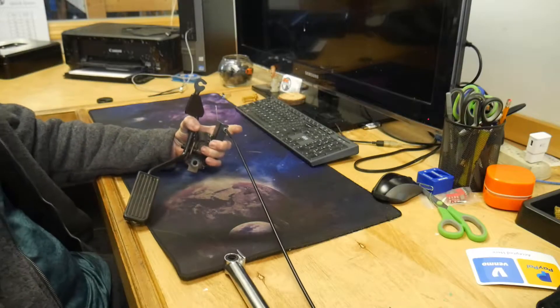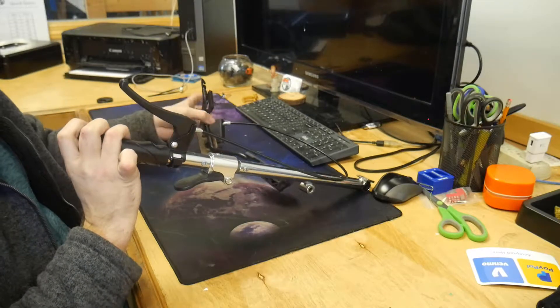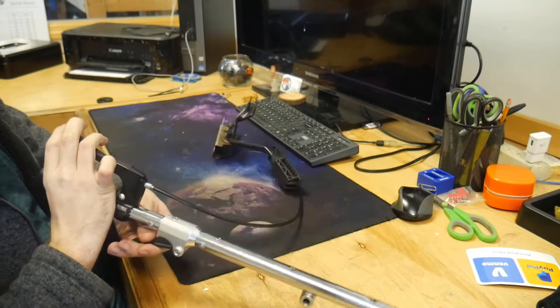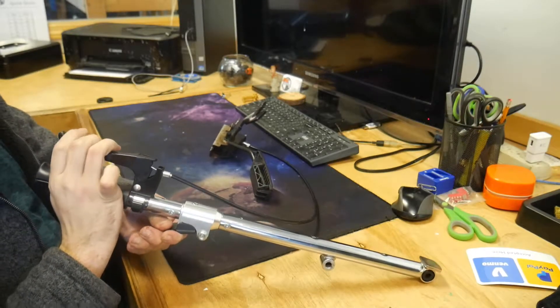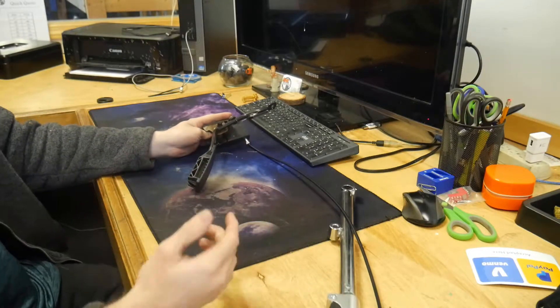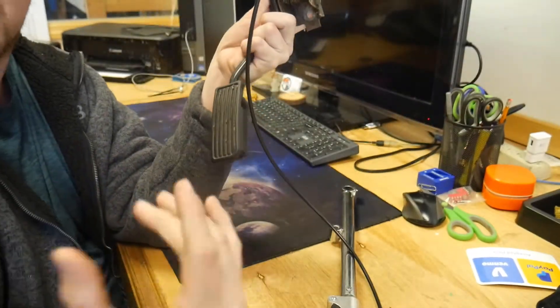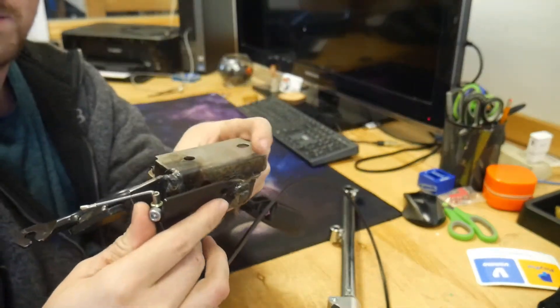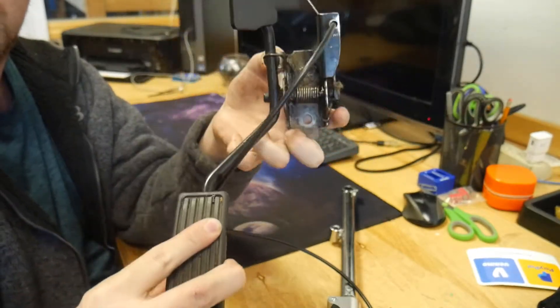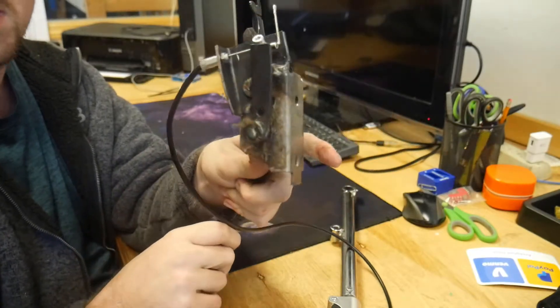This is the general design. This bracket is off an old wheelchair I have. I got this cable — cable drive works like any other cable drive, not that complicated, just like a bicycle brake. And then this is the gas pedal from the element.